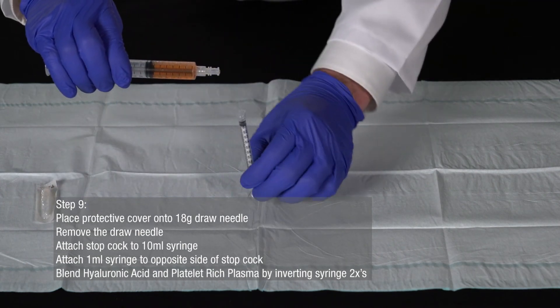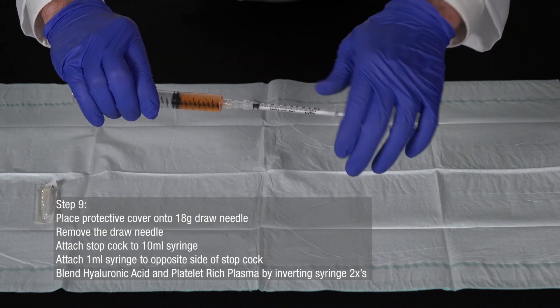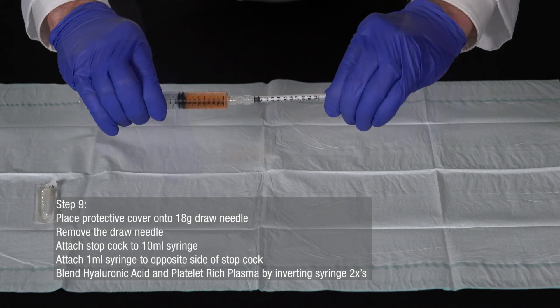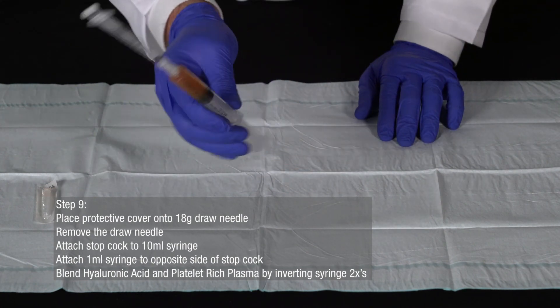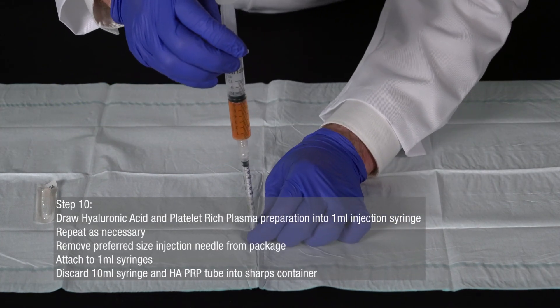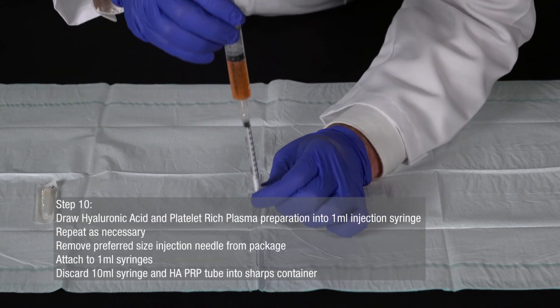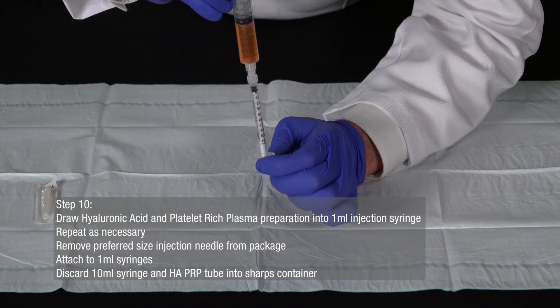Attach a 1-milliliter syringe to the opposite side of the stopcock. To properly blend the hyaluronic acid and platelet-rich plasma, invert the syringe two times. Draw the hyaluronic acid and platelet-rich plasma preparation into the 1-milliliter injection syringe and repeat as necessary.